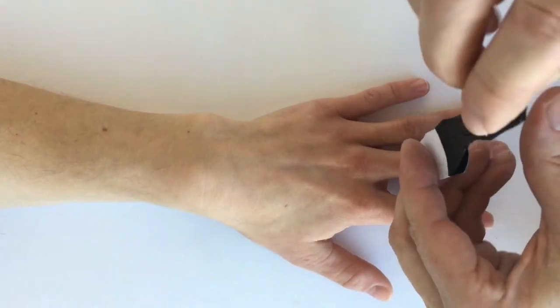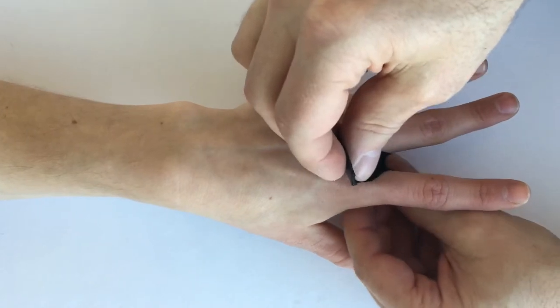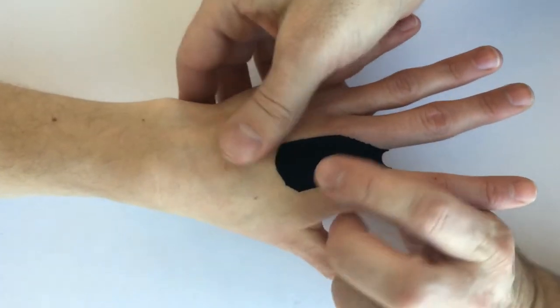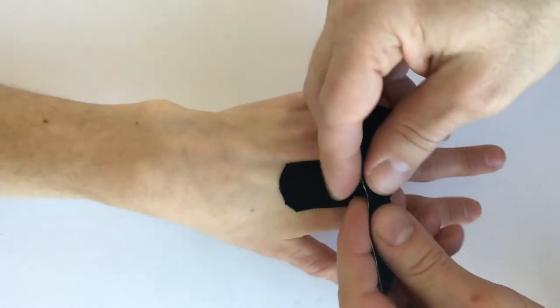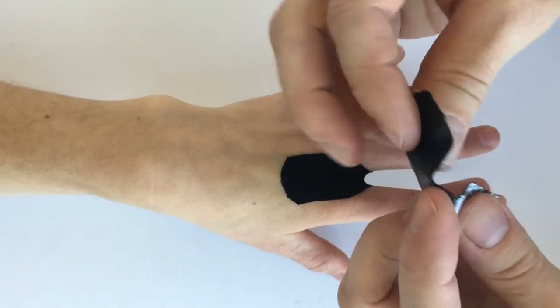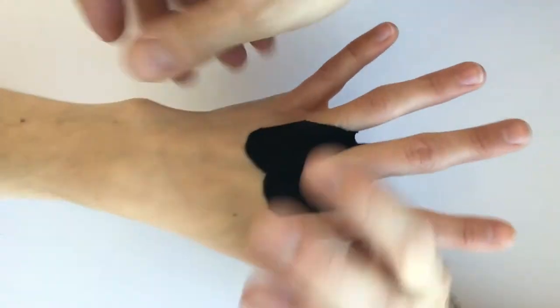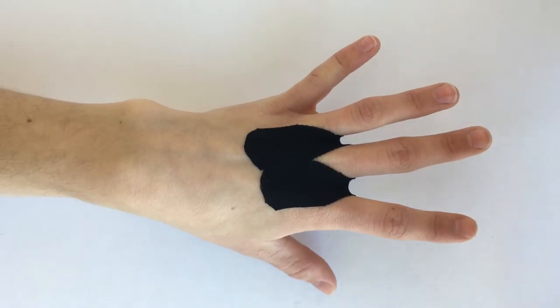I put this kinesio tape on for this technique with just a little bit of stretch. Not a lot of stretch, but just a little bit of stretch, maybe 10% tension, something like that. And just put one in each of the web spaces.